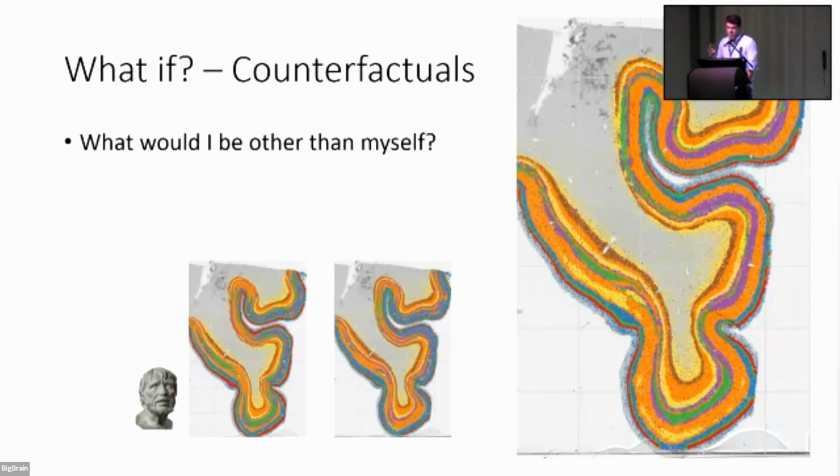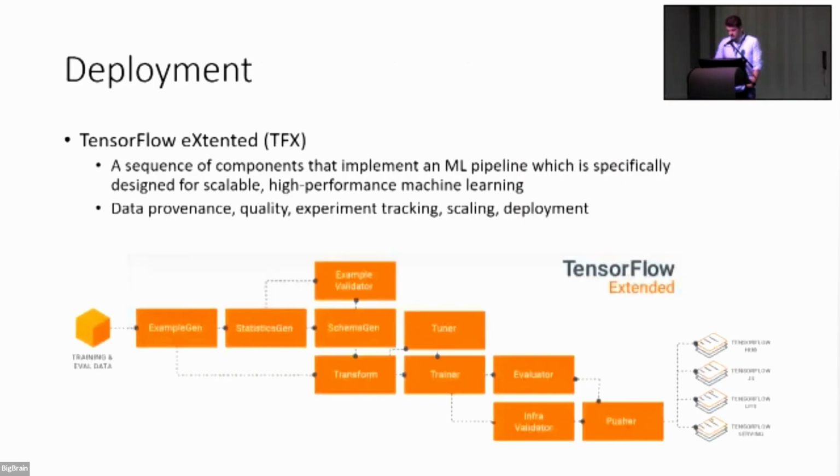Okay, these are layer 3 neurons because that's what was in the input parameters. That's what we learned from raters. But we can also observe here the emerging of this sublayering structure. So with this framework, we can also ask questions such as this, right? And maybe discover also that there are maybe not 6 layers across the cortex, or maybe sometimes more, sometimes less, and also establish which exactly properties of neurons led to that conclusion. Just a short remark about deployment.